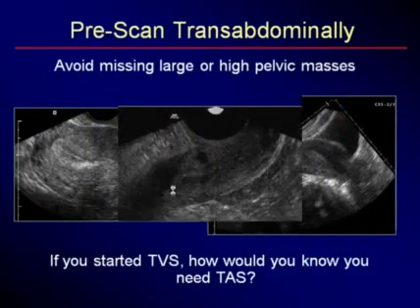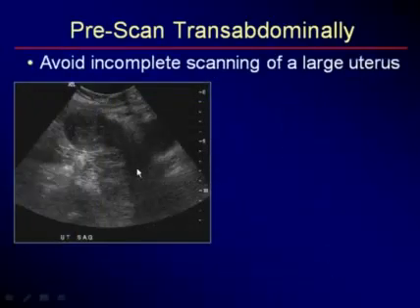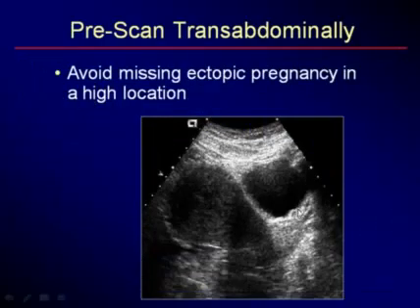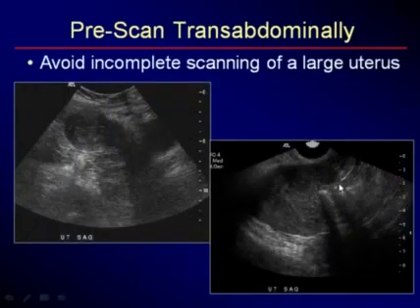Where's the rest of that uterus? So we knew that it was about 11 centimeters long. We searched more carefully, opened up the depth, found that it was really retroflexed, and found the entire uterus. What we were actually looking at was only the cervical part, and we were not imaging the corpus at all.